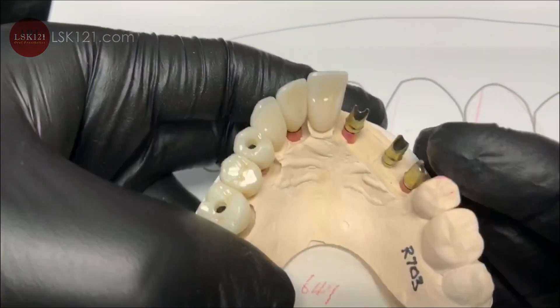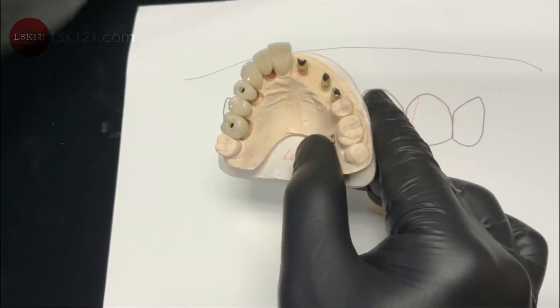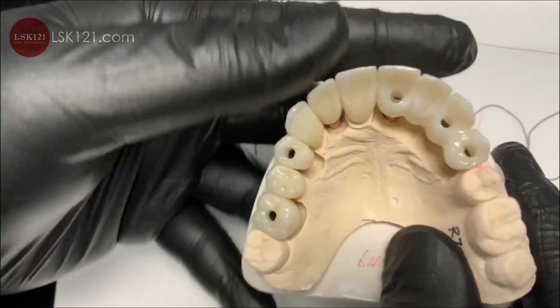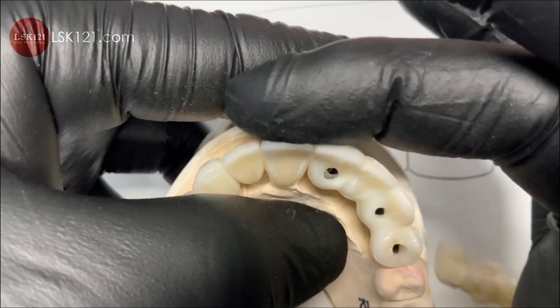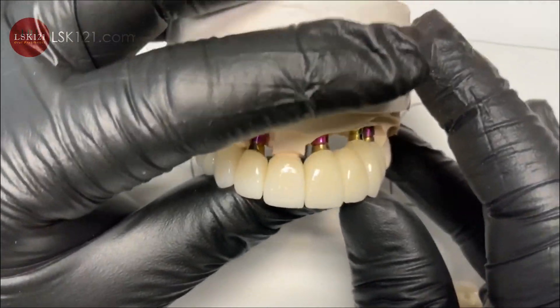Now cemented and ready. We finished with a high value compared to the lower. Now I have good occlusion contact — you can see the same size alignment with the lip support. Here are the finished restorations.